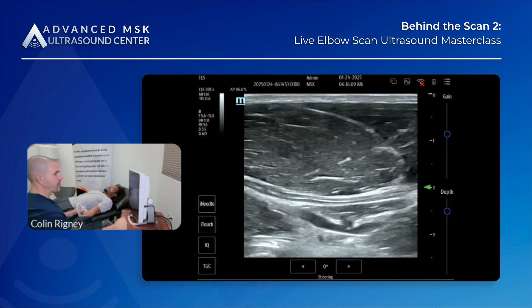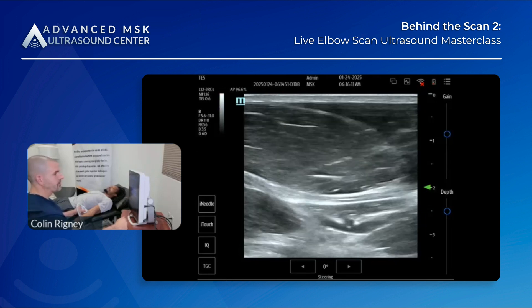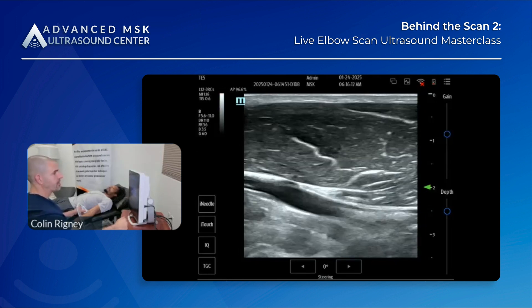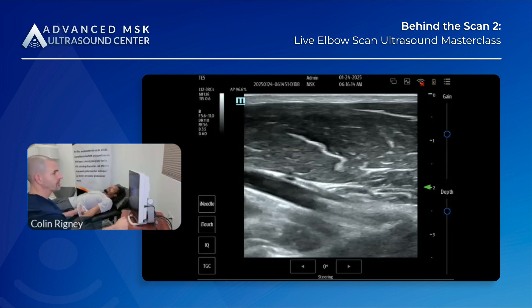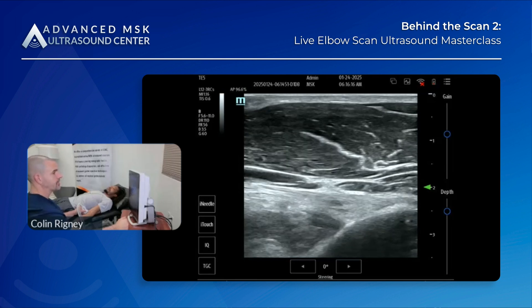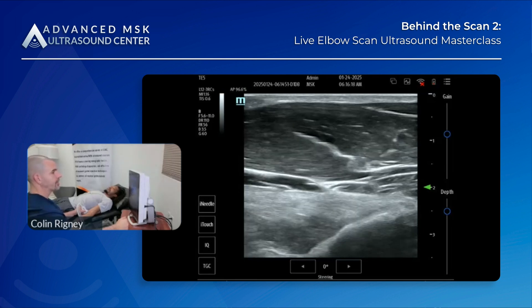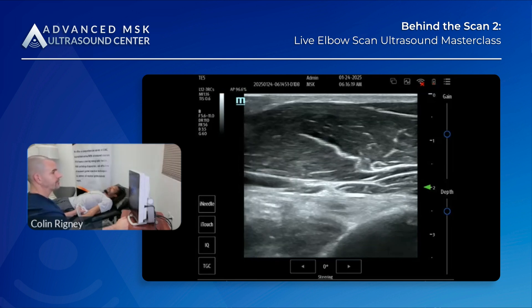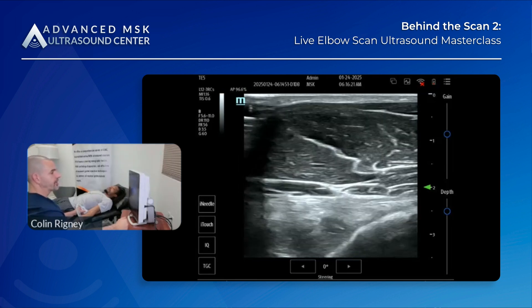The brachial artery sits a little bit medial to the bicep, so I'm going to come just lateral or radial and it slips me right to the bicep brachii. This is your anterior window.